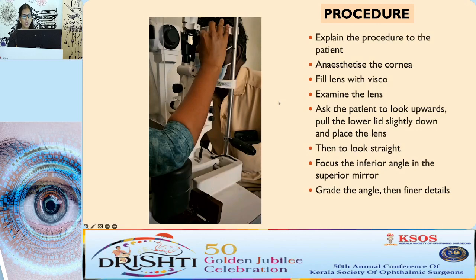Then first of all, you have to focus the inferior angle in the superior mirror because that is the widest angle. Grade the angle, then you can increase the illumination, you can broaden the slit beam and look for the final details.